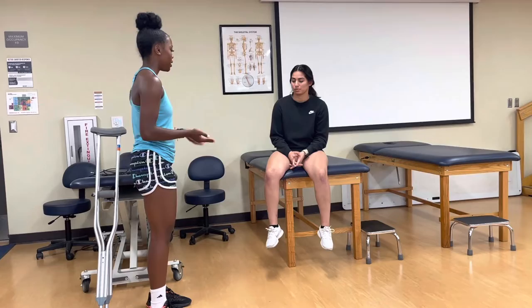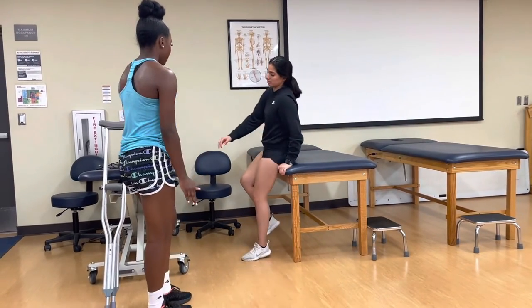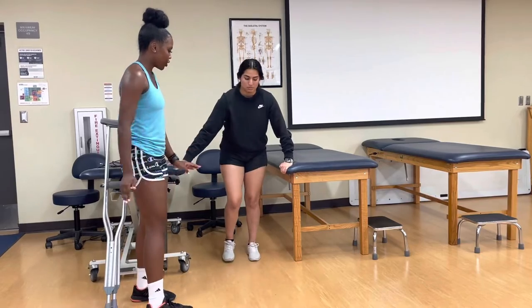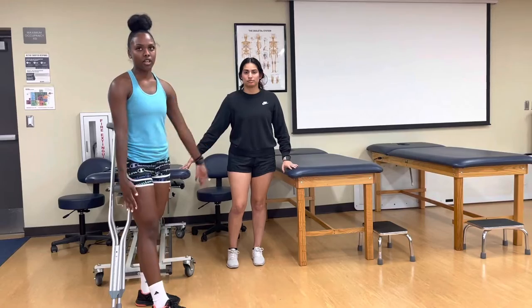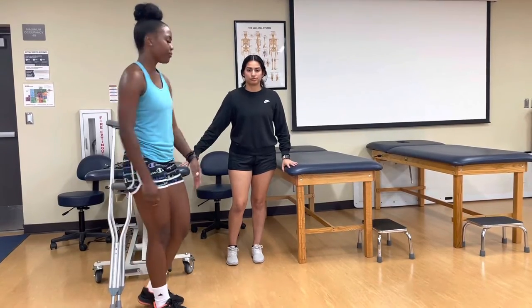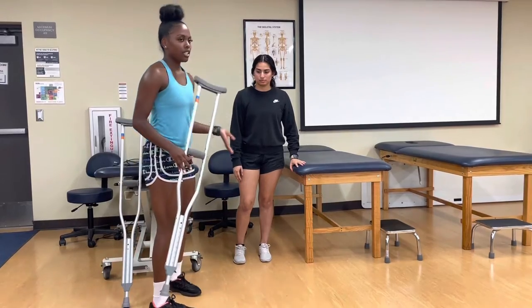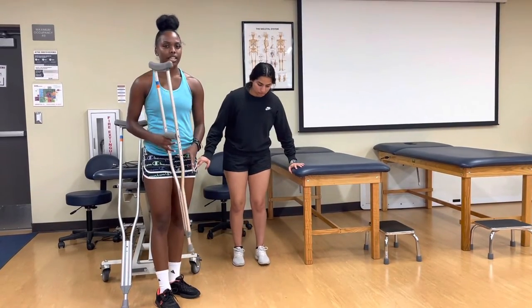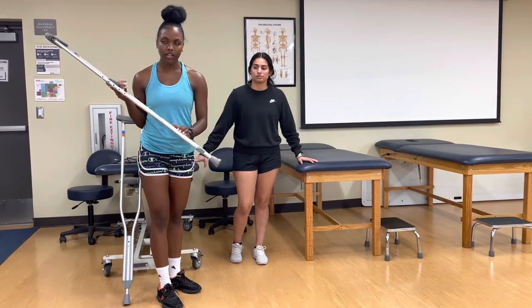Before we begin, I want to have my patient stand up somewhere that they can hold on to to be stable. We just want to make sure that their feet are shoulder width apart and that they stand up tall, with arms relaxed at their side. When we start to pick out crutches, typically you ask the patient what their height is and go from there, because the crutches have different height ranges.